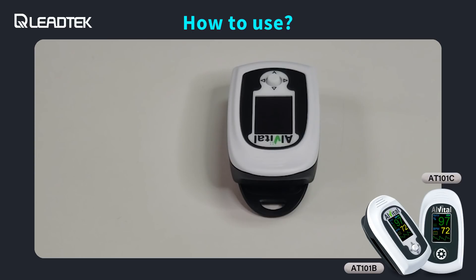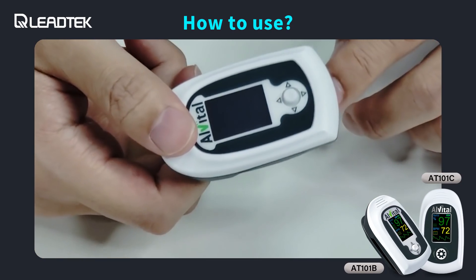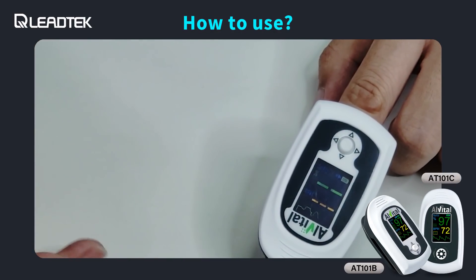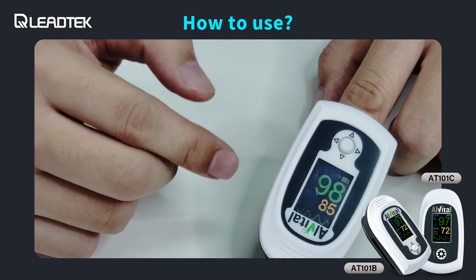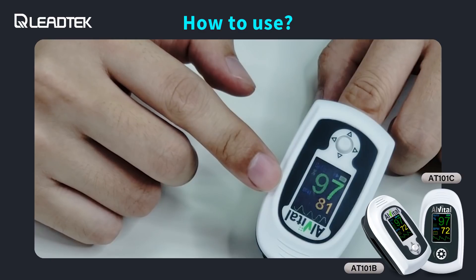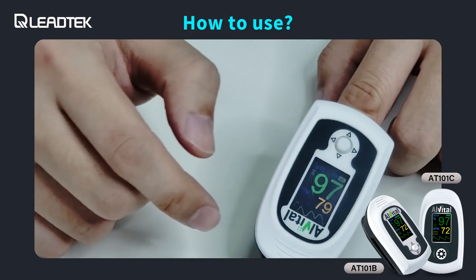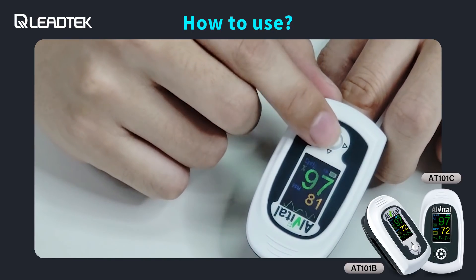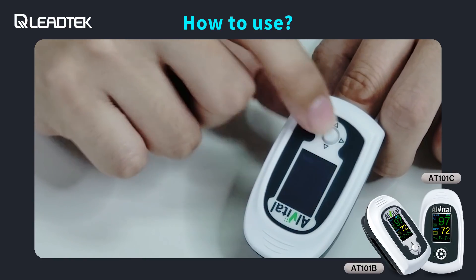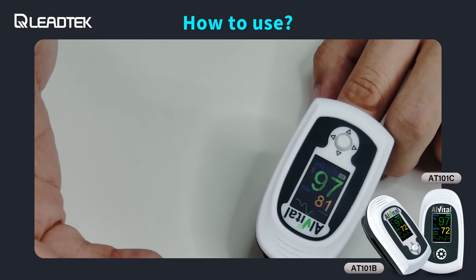Now I will demonstrate how to use the oximeter. It is very easy to use — all you have to do is put your finger inside and it will turn on automatically. Wait a few seconds and it will show you the oxygen level and your current pulse rate. My oxygen level right now is 98 percent and my pulse rate is around 80. We can use this button to change the orientation of the display — up, down, or towards another direction. This is very useful for doctors and nurses to make it easier for them to see.